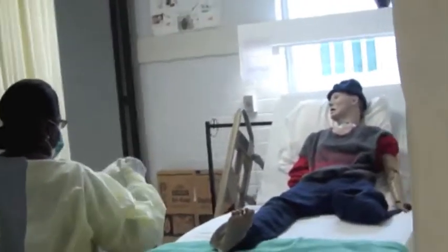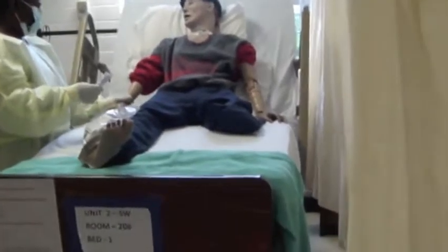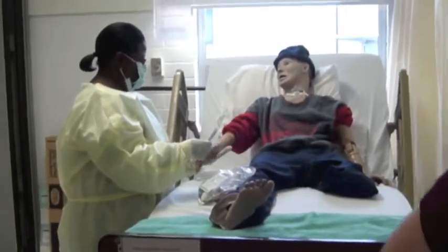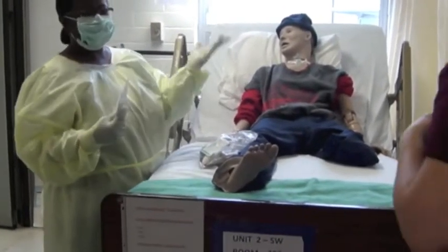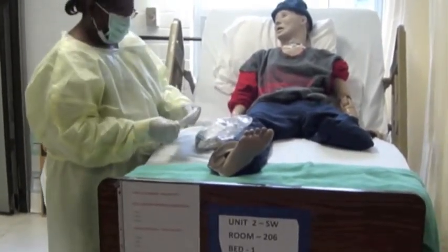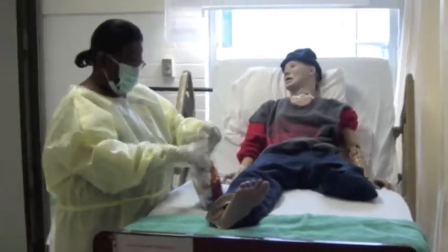I'll work on this side. Can you please tell me your name? Full name, date of birth? Thank you. It's an inpatient, so it's one more thing: MRN. I always ask out loud, but I'm always still constantly looking here, okay? Alrighty, so I'm going to just set that down here.